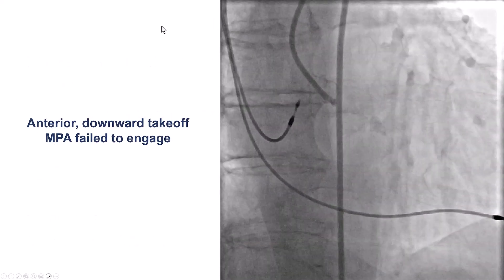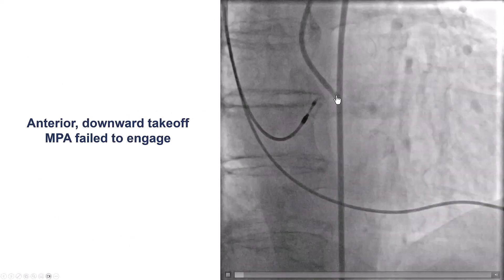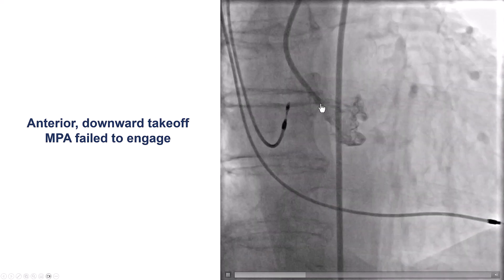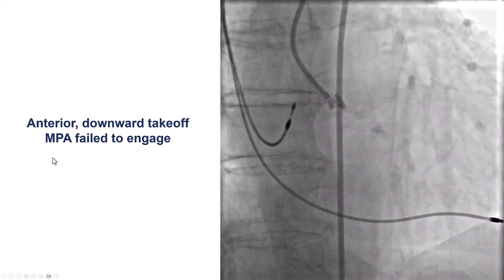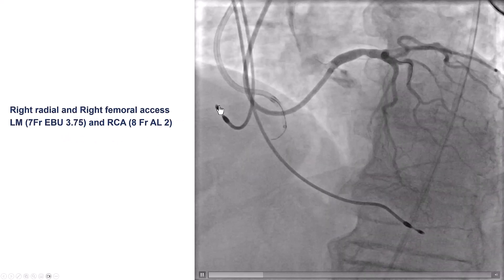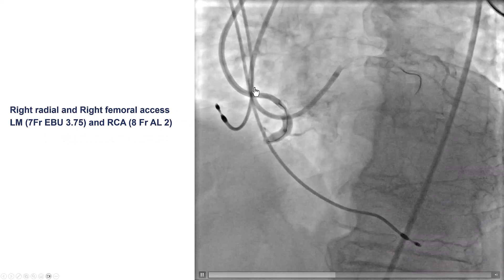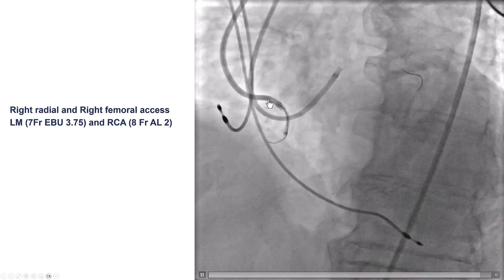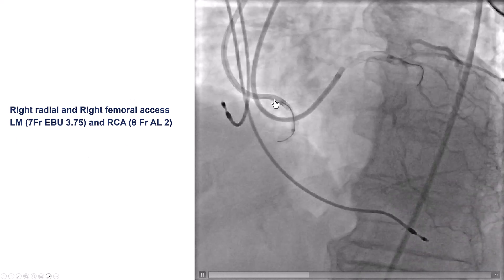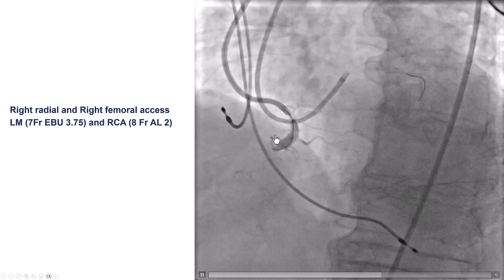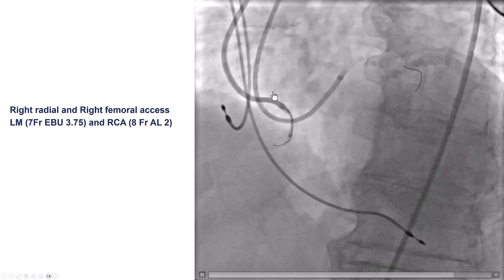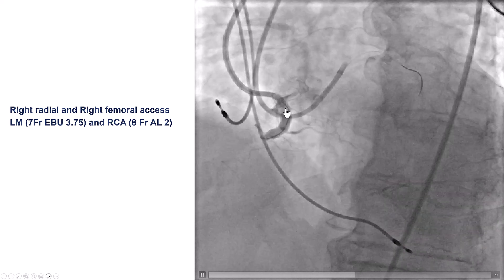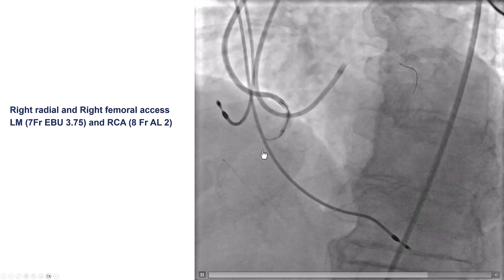These are attempts to engage the right coronary artery. The RCA had an anterior and downward takeoff, and it was very challenging to engage. A multi-purpose guide failed, but eventually, using an AL2 as well as a 7-French BU for the left, we were able to engage the right coronary artery and advance the guide extension inside the proximal RCA. This anterior and downward-pointing takeoff was one of the major challenges that made re-canalization of this CTO more challenging.